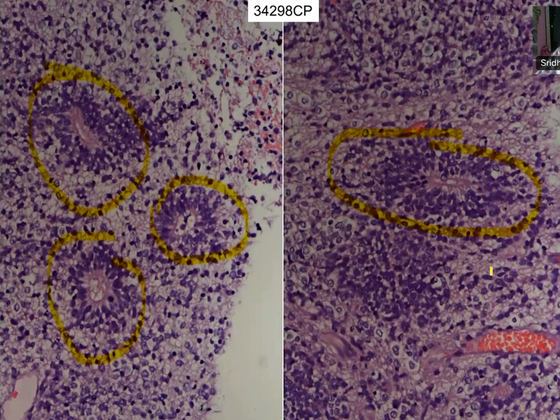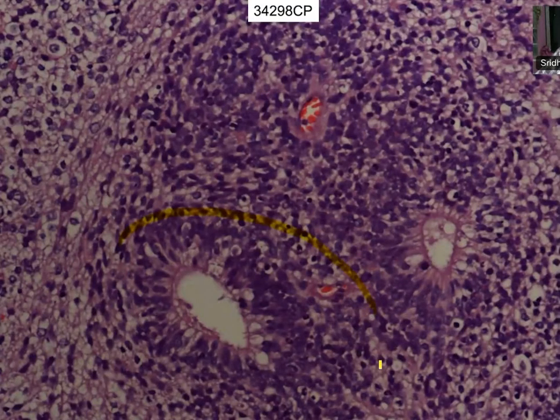Earlier these tumors also used to be called ependymoblastoma, and now they are renamed as embryonal tumor with multilayered rosettes. That is a poorly differentiated spectrum. But both are similar spectrum and molecularly one group only. You can see the same higher picture of multilayered rosettes. Okay, I did not give a classic case.